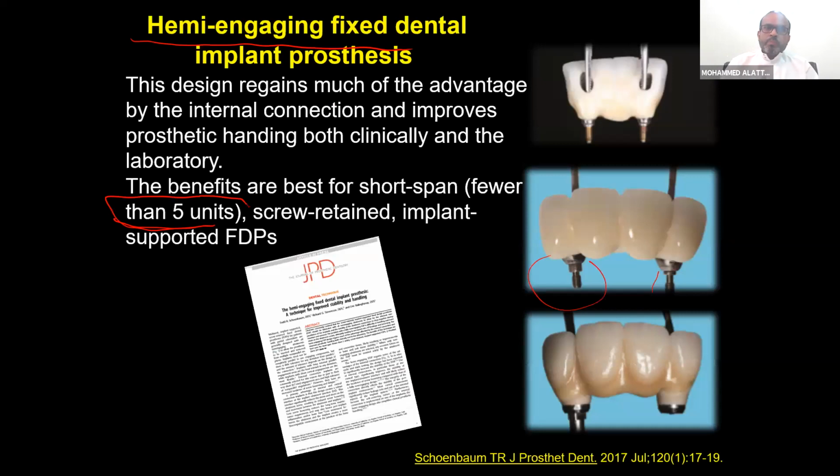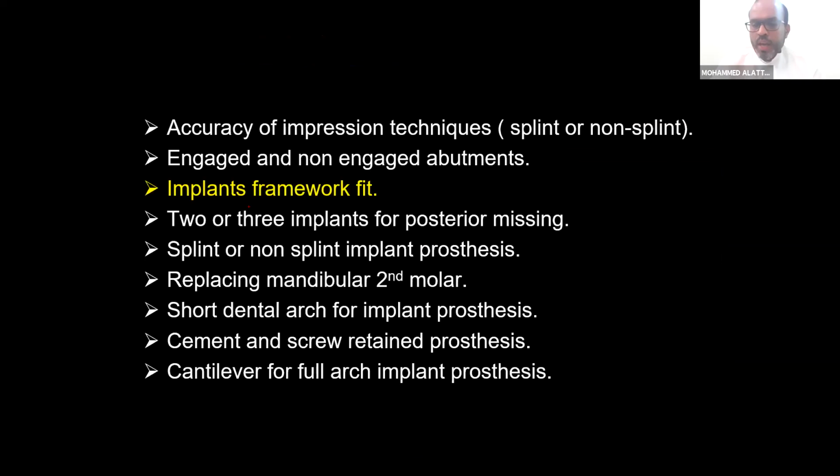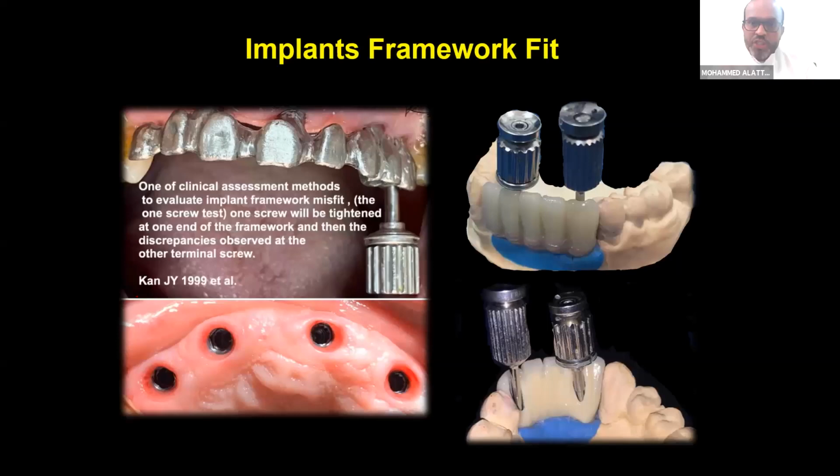What about the third point, the framework fit? How can I examine the fit of my prosthesis? As all of us know, Yusuf mentioned some points for checking the fit of our prosthesis. You can fit your metal superstructure or your final prosthesis, do one screw test, and see how the fit of this prosthesis is.